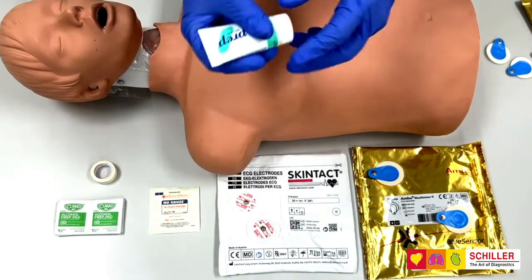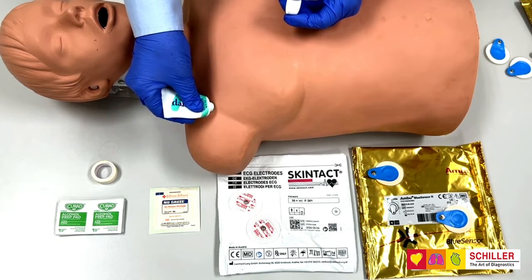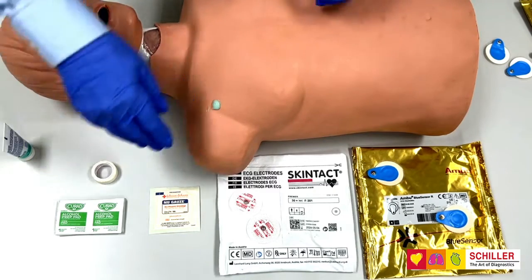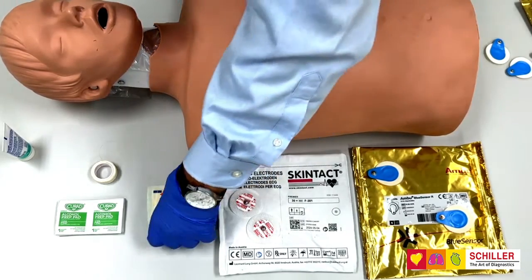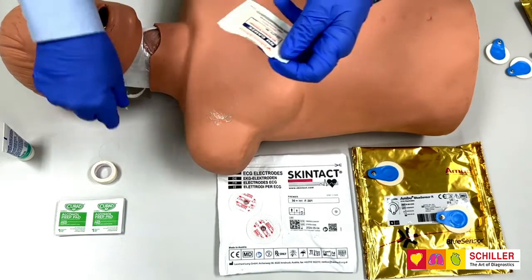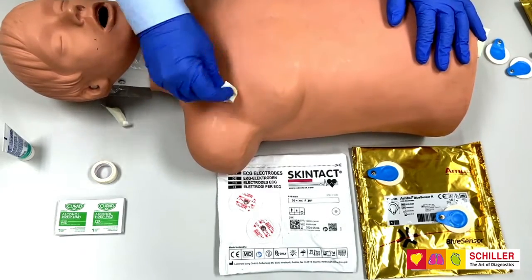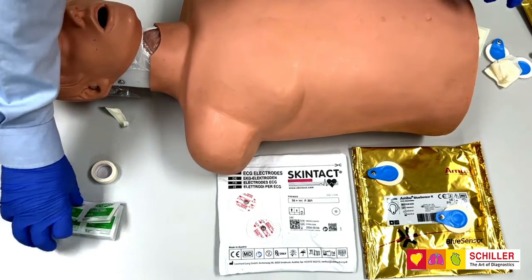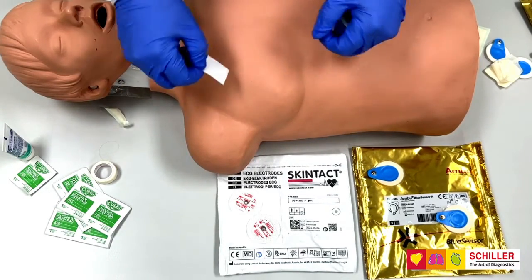When you are preparing, open the Nuprep and place a dime-size portion directly on the skin of the patient and gently rub in. Once you've done this, with a gauze, remove the Nuprep, and with an alcohol pad, clean the area in which you will place the electrode.